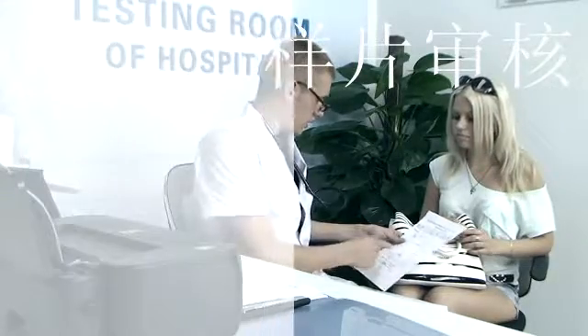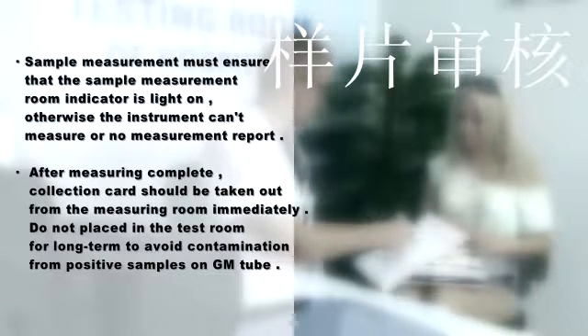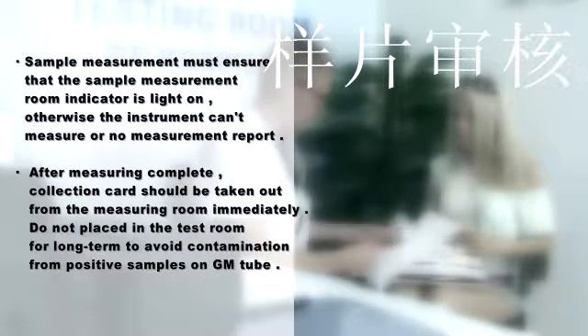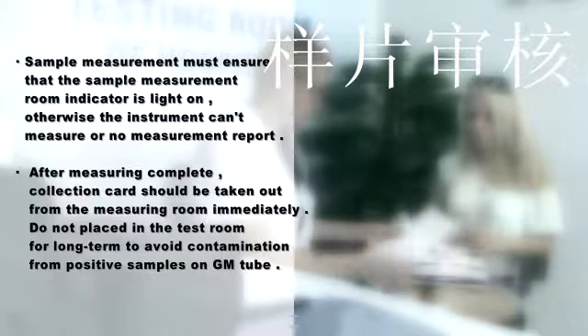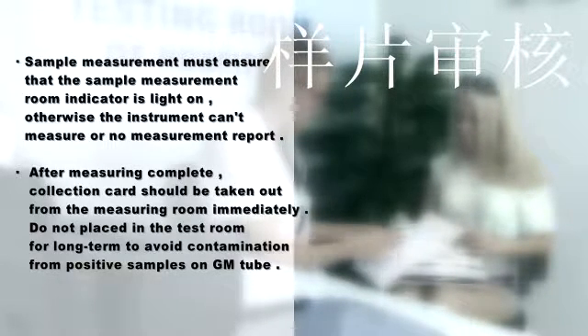The screen will then display the results. Sample measurement must ensure that the sample measurement room indicator light is on; otherwise, the instrument cannot measure or no measurement report will be generated. After measurement is complete, the collection card should be taken out from the measuring room immediately. Do not place it in the test room long-term to avoid contamination from positive samples on GM tube.